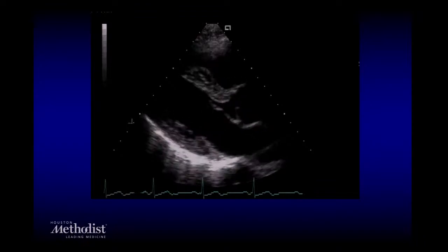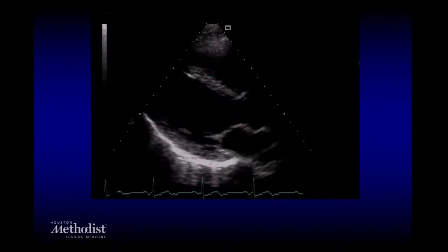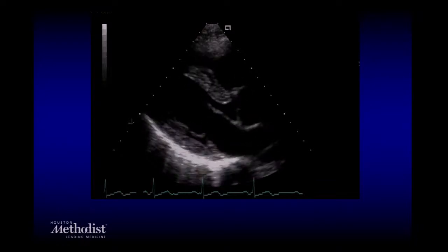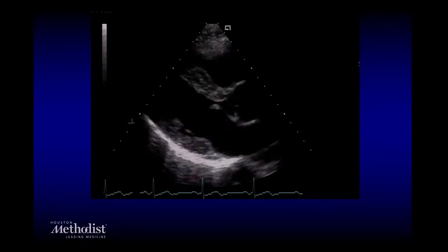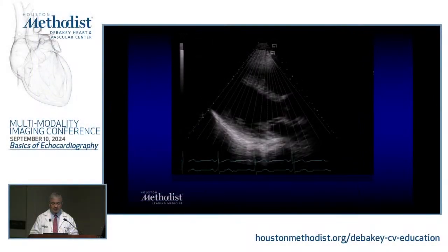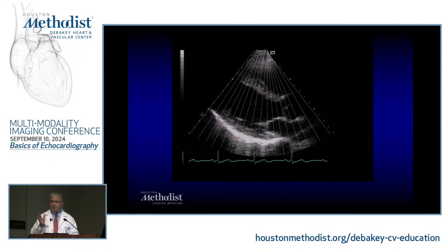Interestingly enough, for the heart, as opposed to other structures using ultrasound, we have a small window for us to be able to image from between the ribs. So we have a sector that moves these scan lines from one place to another, as opposed to if you want to take a look at the carotids, you don't have such an issue. So you could have linear probes as opposed to a sector probe, just like this one. With a linear probe, the lines come up and down parallel to each other. Here, you're going to have to spread them apart over time.